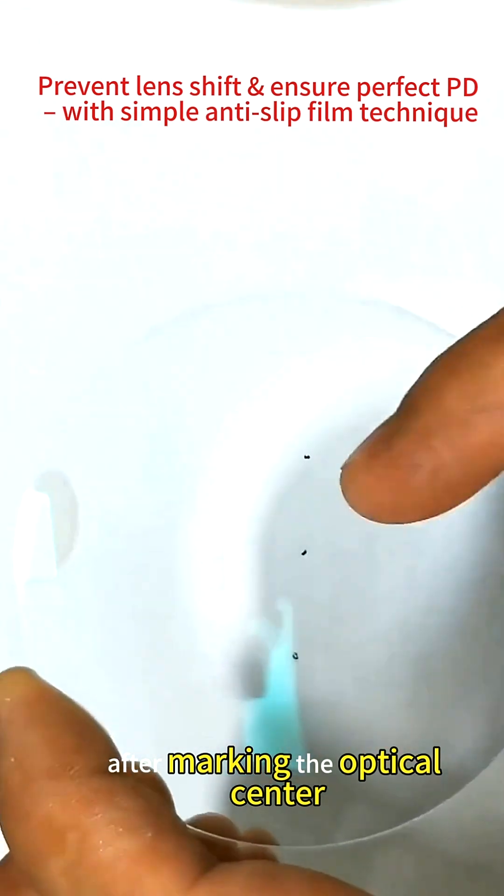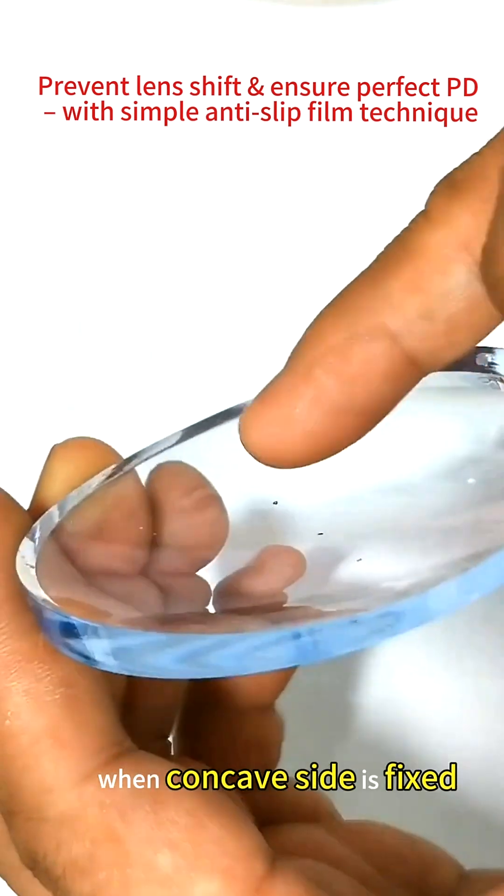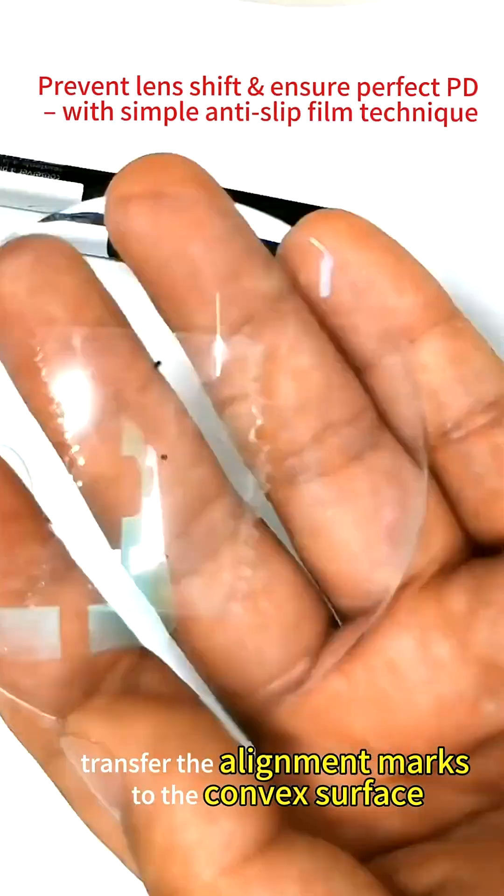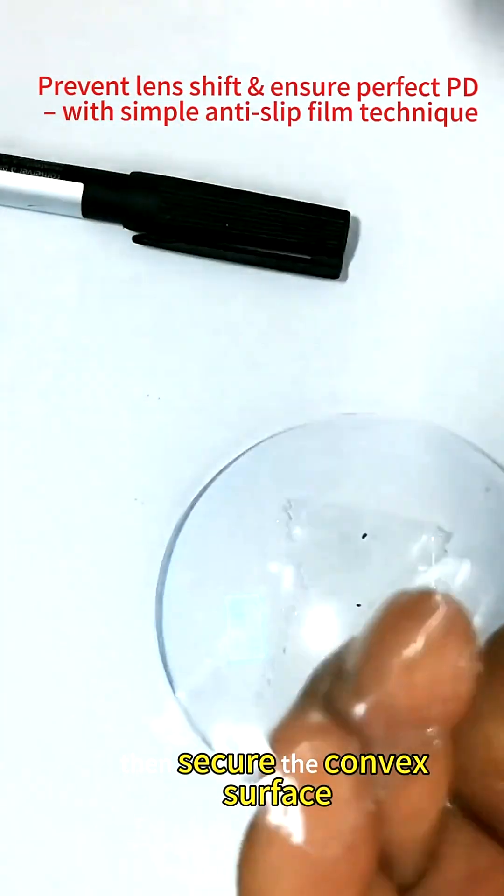After marking the optical center, apply to the concave surface first. When the concave side is fixed, transfer the alignment marks to the convex surface. Then secure the convex surface.